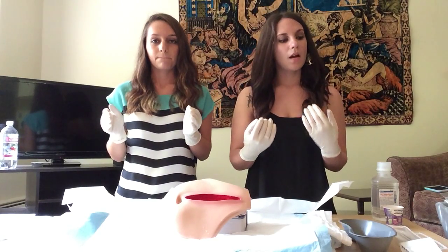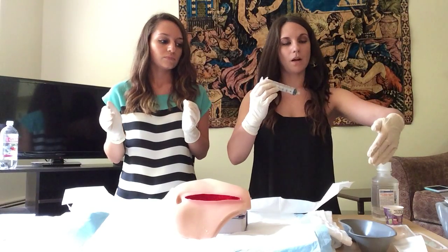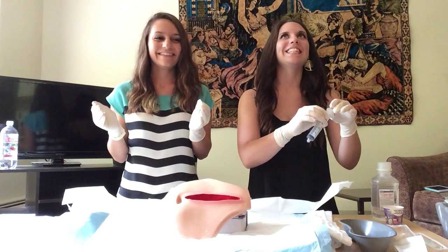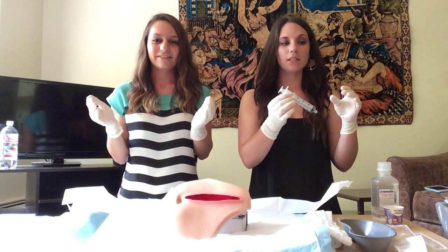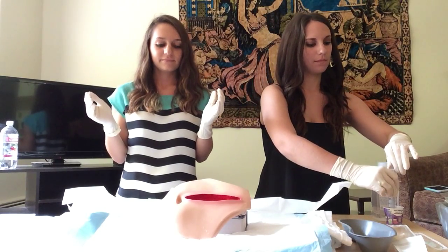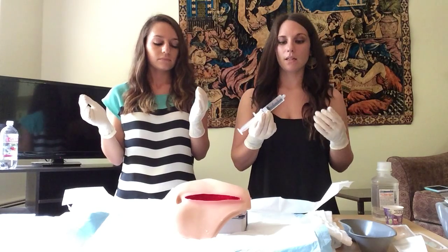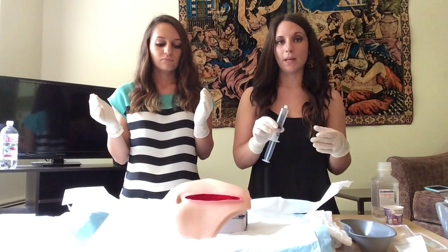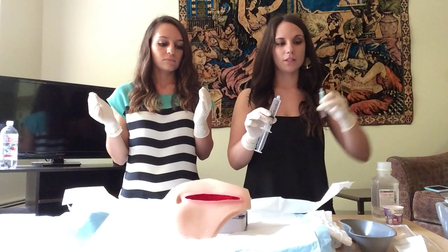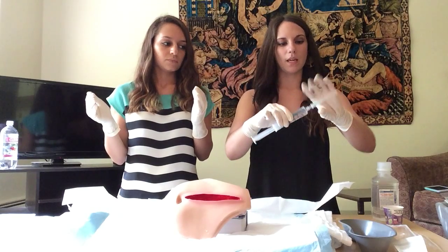After we inspect our wound, I'm going to take the 30 milliliter syringe from its sterile packaging, and maintaining sterility, I'm going to draw up the sterile solution that I poured previously. The amount of solution injected into the syringe depends on what the physician ordered. After that, I'm going to apply my 18-gauge catheter tip, again maintaining the sterile field, connecting both the syringe and the catheter tip.